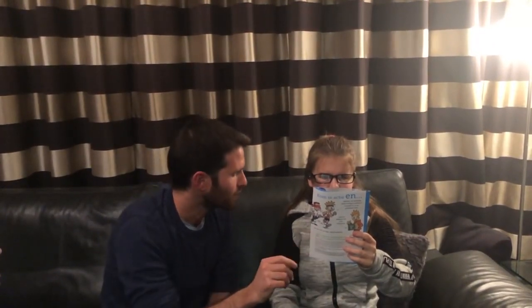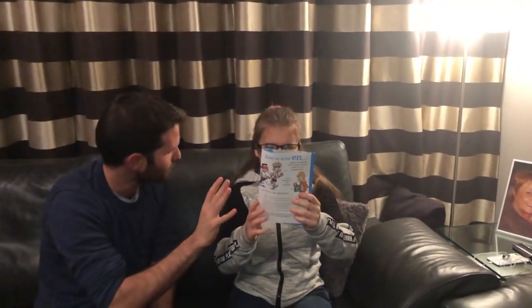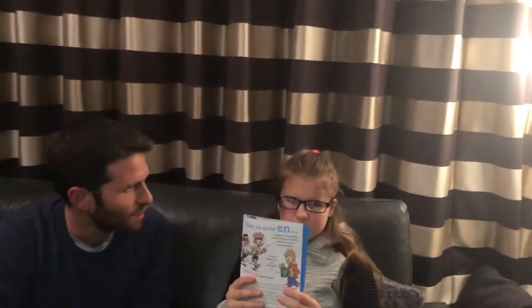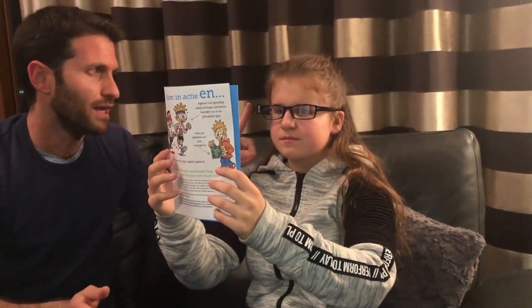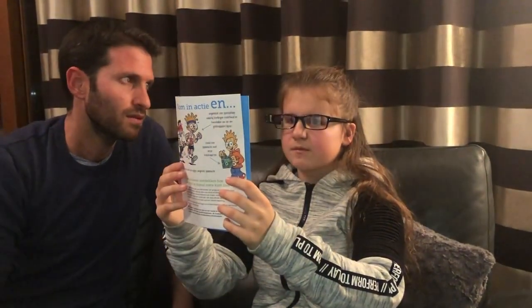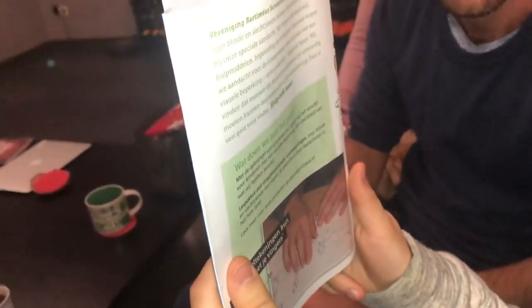You need to try to hold the page exactly in front of you — in front of your nose. Try to imagine that the page is in the center of your nose. You can take the page away because it already took a shot, it took the picture of the page, and now it's reading out loud. You can sit back and relax.